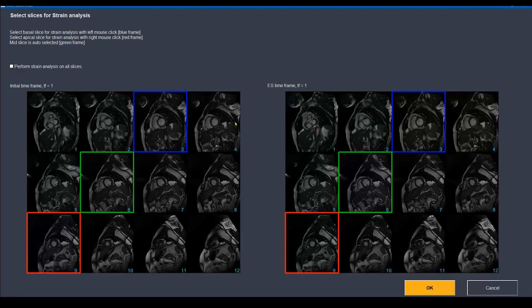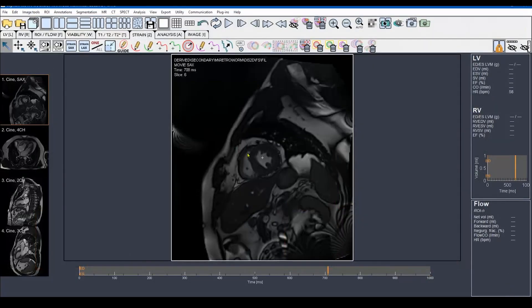So what's the problem with that? The problem is that if I select this nice slice as a basal slice — it's perfect during diastole or the initial time frame — but I don't know how it will look during systole. There is cardiac motion and longitudinal shortening during systole, so the heart is pulled downward. This slice may cut through the LVOT or aortic annulus and lose some parts of the myocardium, giving very wrong results. So I will cancel this step and go back to set the correct end systolic phase.